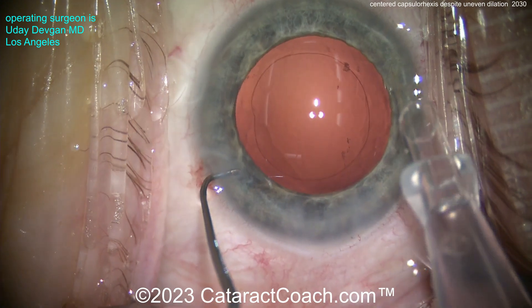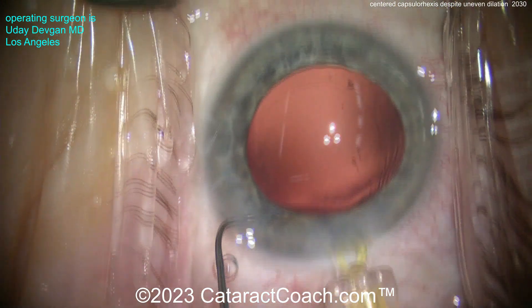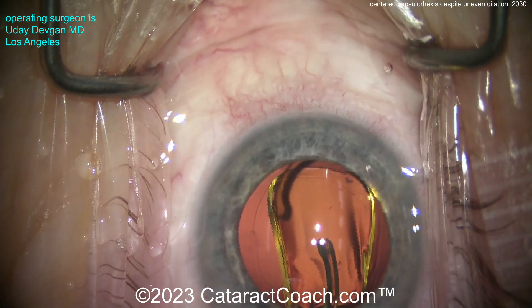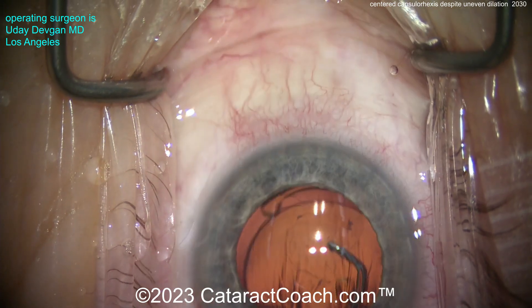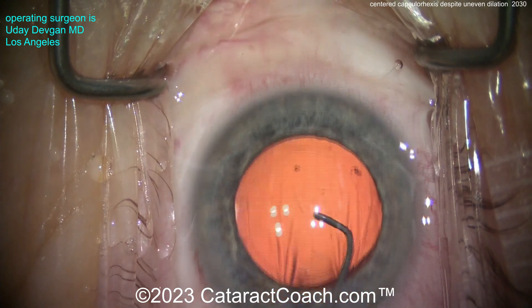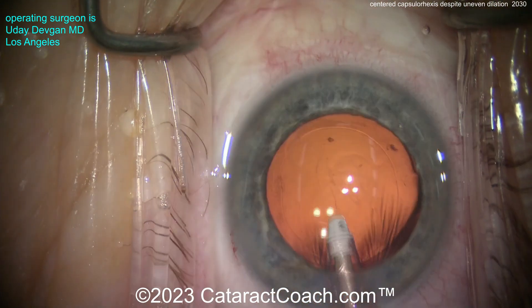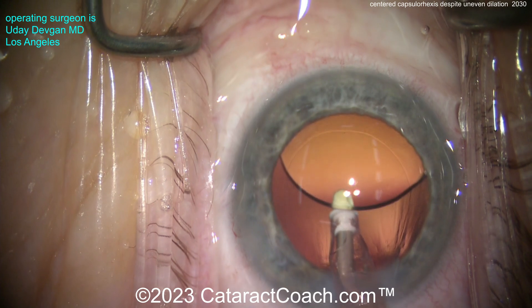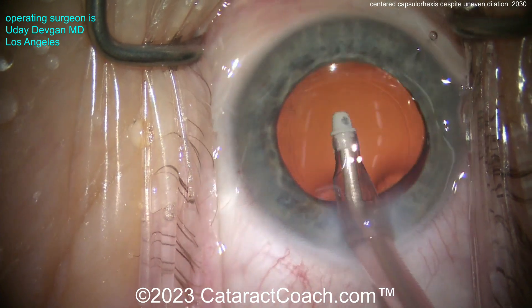Here comes a single-piece acrylic lens. And you can see that's a beautiful looking rhexis now. We still have cohesive viscoelastic in the eye — that's what's keeping the pupil kind of dilated as well. Once we get this lens in the capsule bag and take out the viscoelastic, the pupil may move around a bit. And we're still happy because we can be ensured that that rhexis is still beautifully centered, five millimeters or so in diameter, overlapping that optic 360 nicely and securely holding that optic in place. Looking good. Viscoelastic removal — go behind the lens optic. Vacuum — take all that stuff out. Set up our lens again, maybe a little bit more cleaning up here. Looks beautiful.